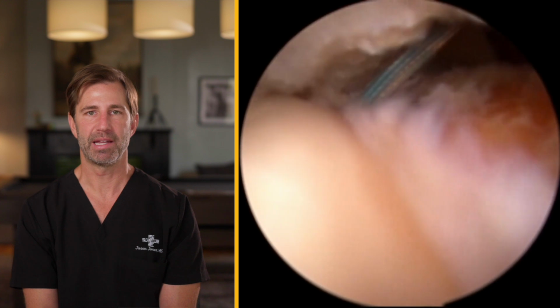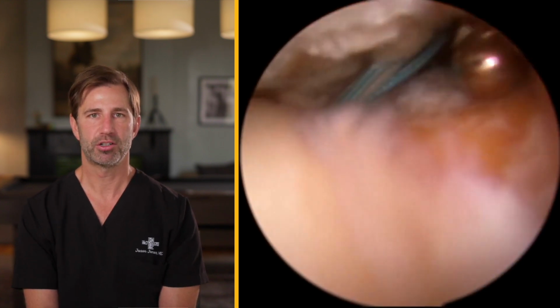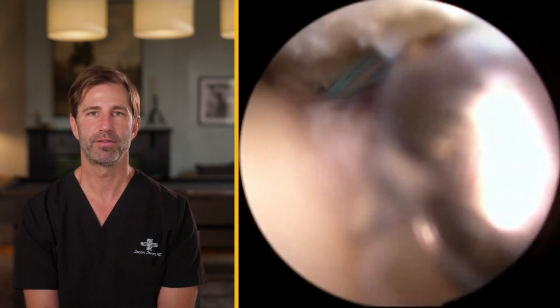2 anchors have been placed at this point, and after placing these 2 anchors, we're able to pull the rotator cuff back over to its native attachment, and this will allow for healing of the rotator cuff itself.